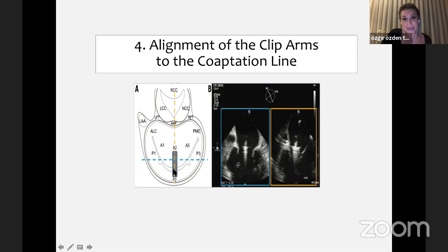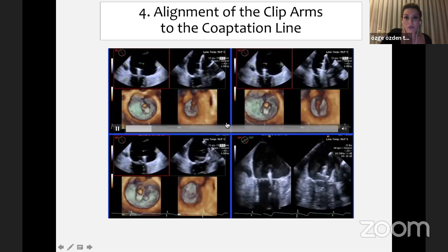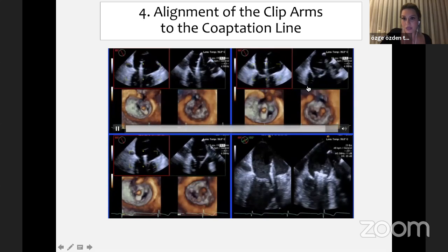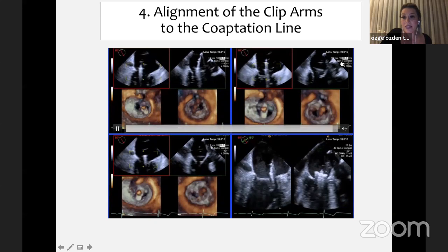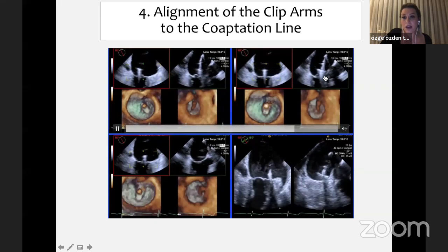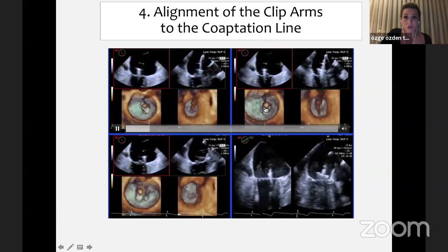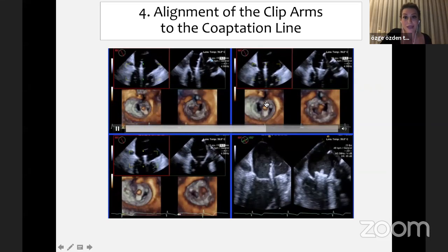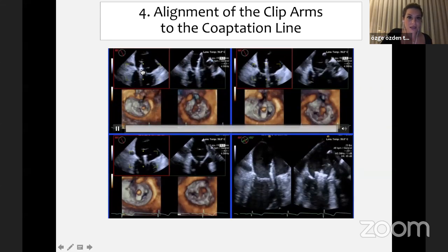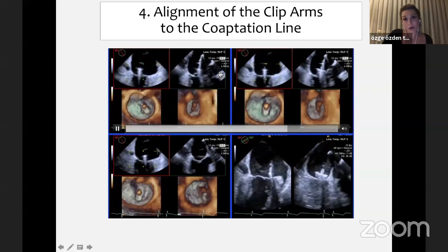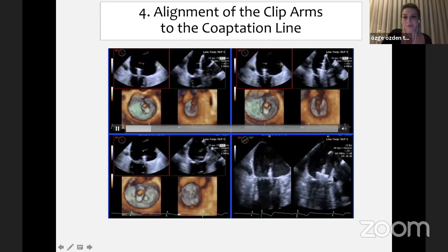This is the advancement of the clip delivery system. You can see how we rotate and play with the catheter. To my opinion, one of the most important steps is alignment of the clip arms to the coaptation line. If we are planning to put one clip to the A2P2 zone, we need to be perpendicular to the coaptation line. In the en face surgical view with the aorta at 12 o'clock, A1, A2, A3 are from left to right with corresponding P1, P2, P3 scallops, and we want to be perpendicular to A2-P2 with our clip.